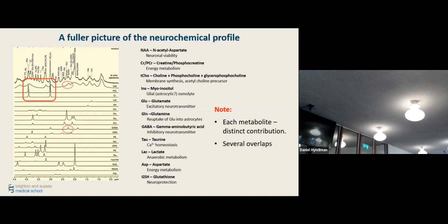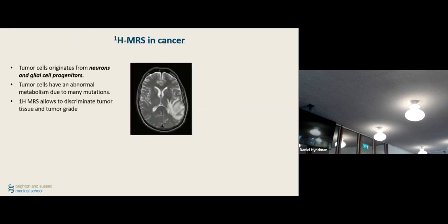And you see, this is an experimentally acquired macromolecular baseline that is really not interpretable, but has lots of nuisances that interfere with quantification that we will talk about later on. And indeed, there is a significant contribution from macromolecules. A very quick run through, I just want to make sure that I'm good with time, a very quick run through some applications of MRS.